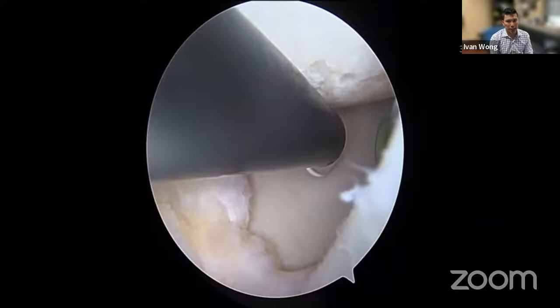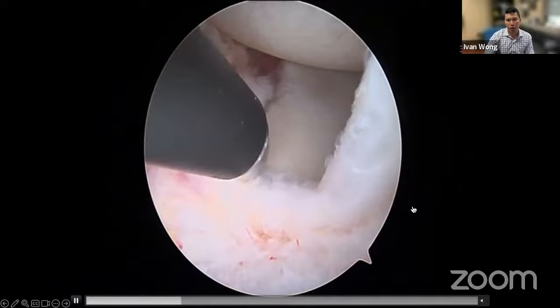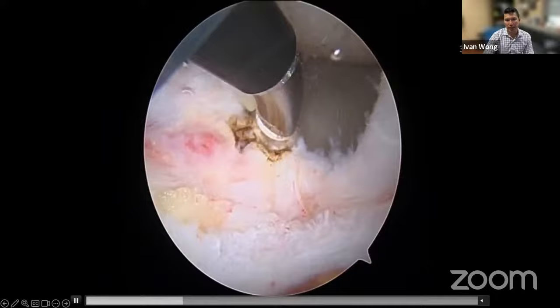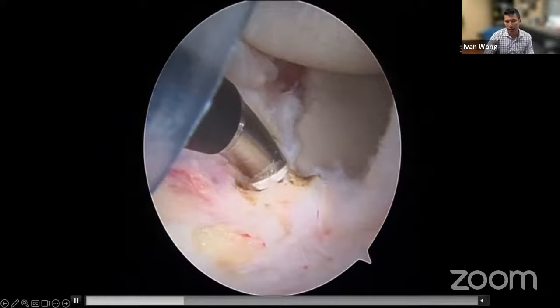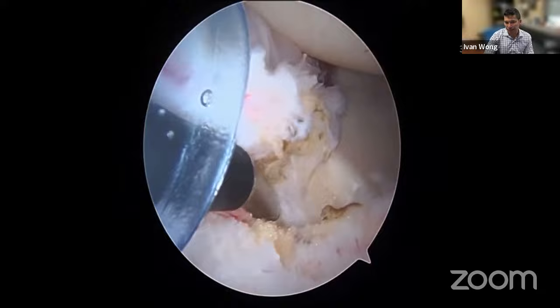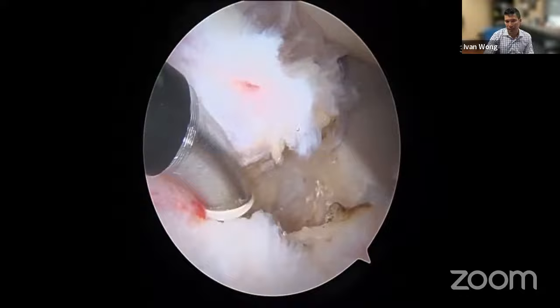We now release the tissue between the traction stitch and the biceps tendon. If 12 o'clock is at the biceps tendon, I go roughly to one o'clock, taking more tissue from the biceps side because that's where I want to place the last anchor. We're planning ahead: we want to reattach the labrum from the traction stitch at three o'clock back to the 12-to-one o'clock position. This labral releasing stitch is not a typical step in traditional Bankart repair, but now that we have reliable knotless anchors, we can dock that traction stitch back onto the anterior glenoid rim and get consistent healing.